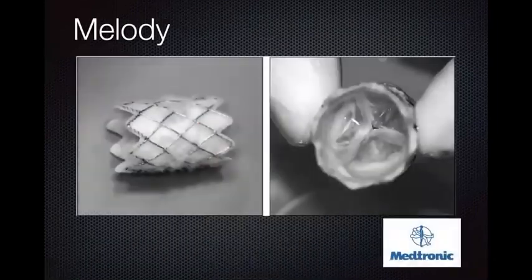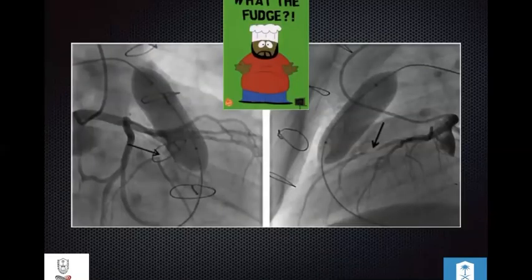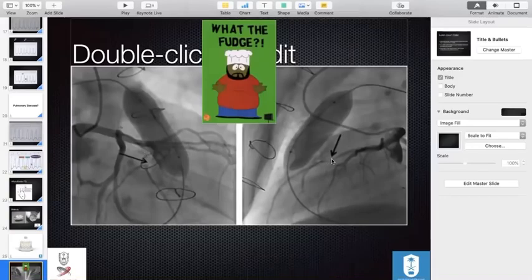So usually the treatment of pulmonary stenosis is percutaneous. Before, we usually used a lot of Melody valves. Currently, we have started to use more Edwards Sapien 3, which is more convenient. But before you commit to putting in a valve, you have to test. You have to balloon first. Why is that? You see here on your left side, you balloon, and then you see if there's any compression of the left system, and you can see it is actually happening. And this is the time you do not put the valve in, because of coronary flow compromise and patient arrest.